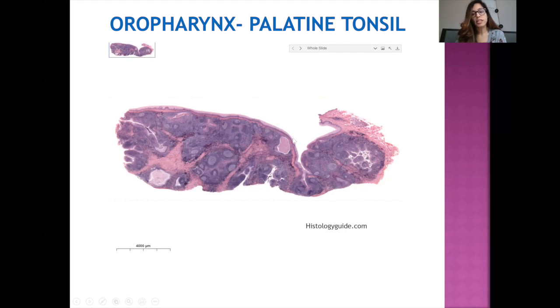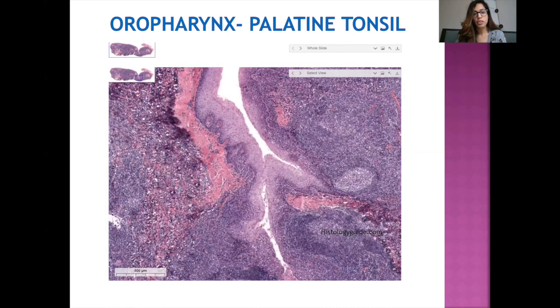And we can also see that the squamous mucosa actually dips down along these lymphoid follicles and then comes back up. These dipped areas are what are referred to as tonsillar crypts, and you can see cross sections of them below in the mucosa here and here as well. So the concept of tonsillar crypts is actually very important. So here I have a crypt in a medium power. And again, you can actually see the squamous mucosa and its intimate association actually with the lymphoid cells.